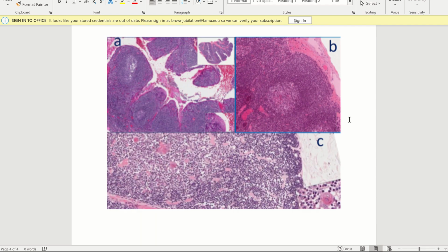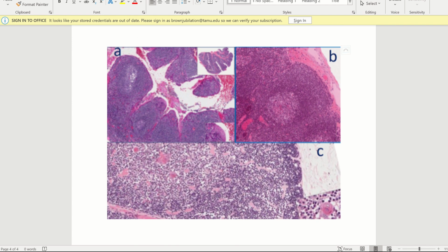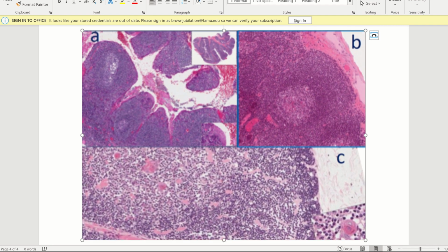This one, this is our last image. So this one is going to be lymphatic tissue. So this is the lymphoid system, and maybe we're going to be identifying these little organs in here. What A is going to be pointing to is the tonsils. Remember the tonsils have a bunch of crypts. So these are all tonsillar crypts that this is depicting. You can really see that up there, tonsillar crypts within here.